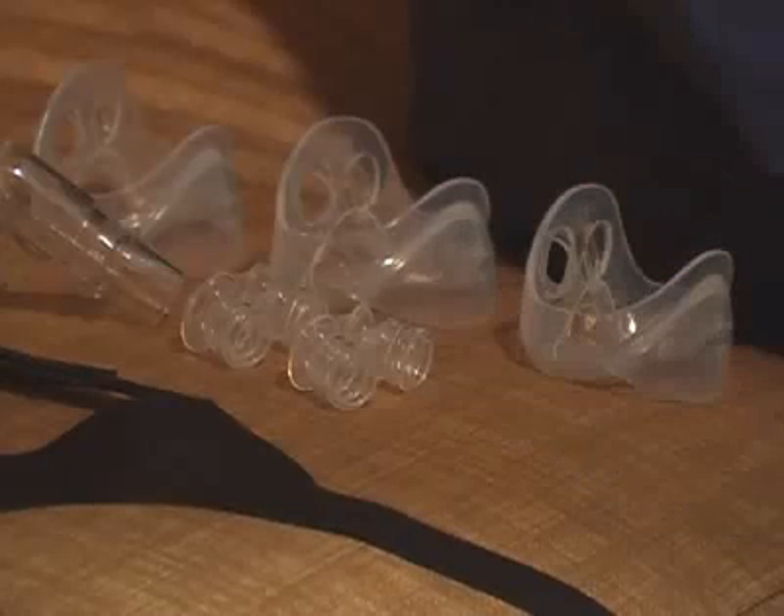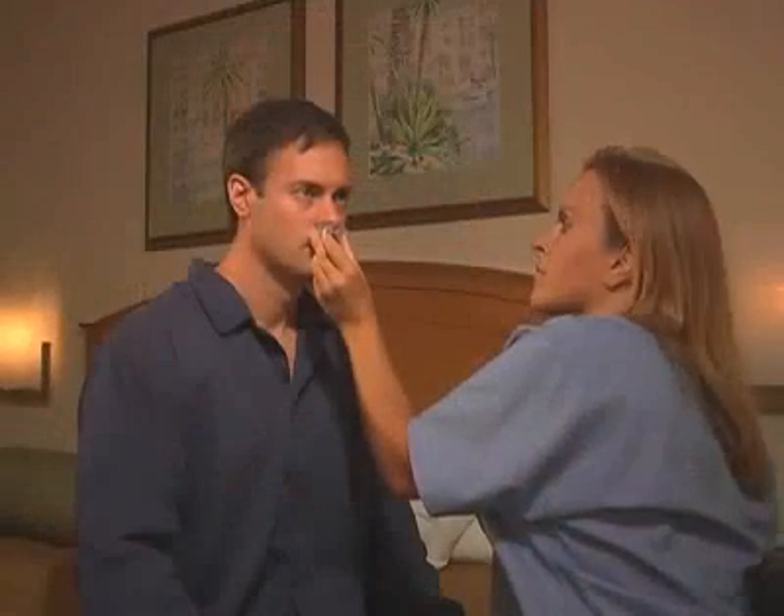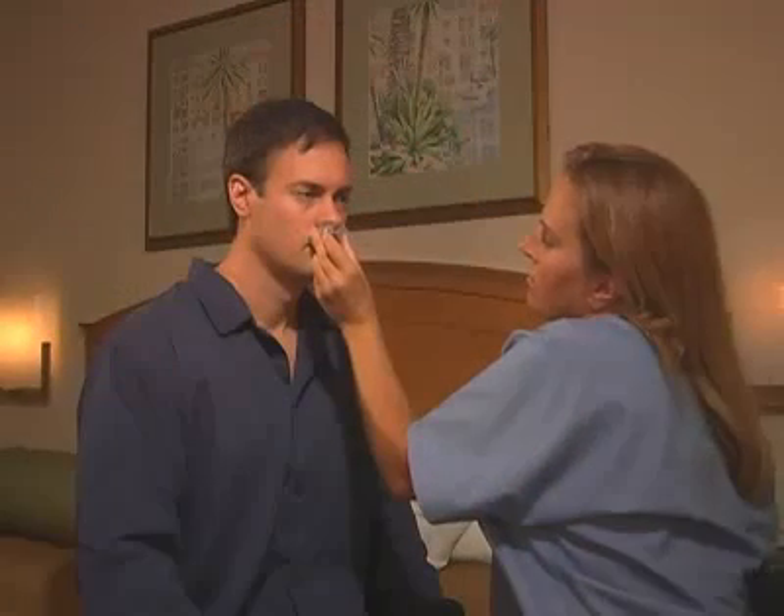To determine the appropriate nasal pillow size, visually inspect the patient's nostril and choose a corresponding nasal pillow. An appropriate nasal pillow size should enter the nasal opening and form an adequate seal between the pillow and the rim of the nostril. An inadequate seal is detected by a rush of air felt by the patient and possible noise caused from air leaking around the pillow when the interface is connected to a pressure device.